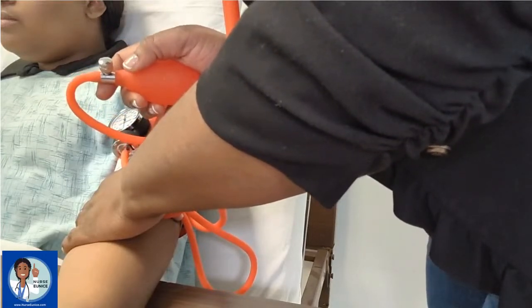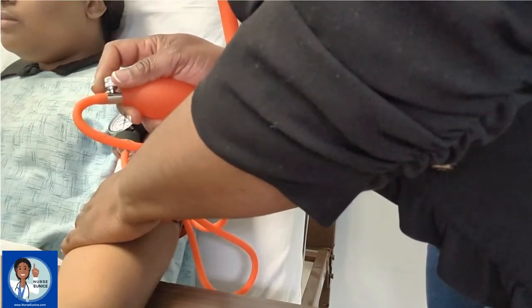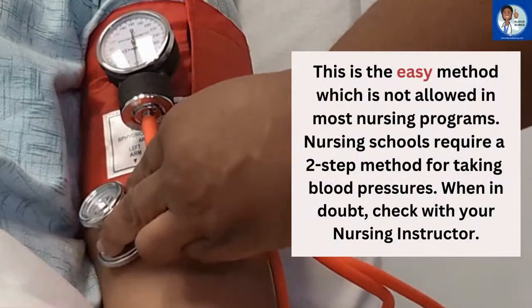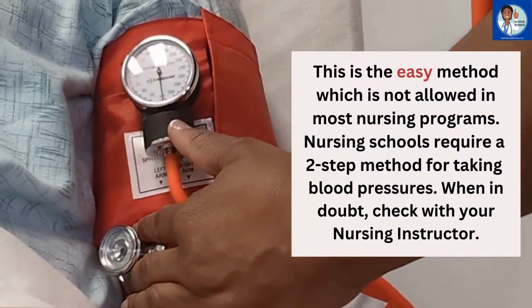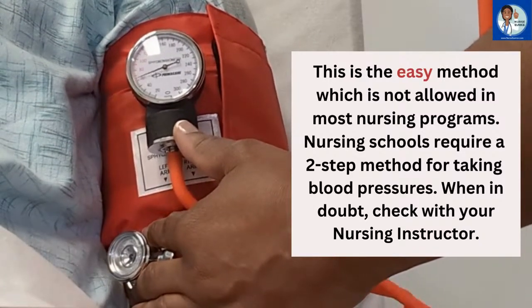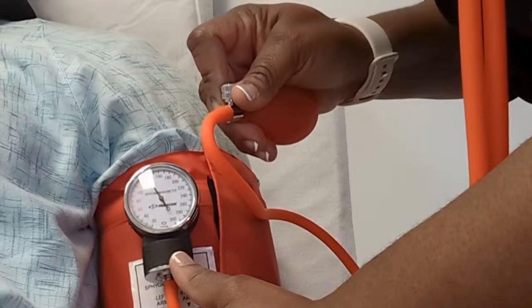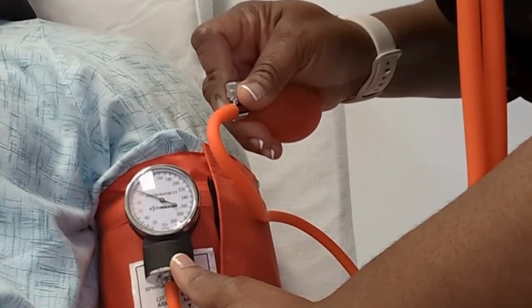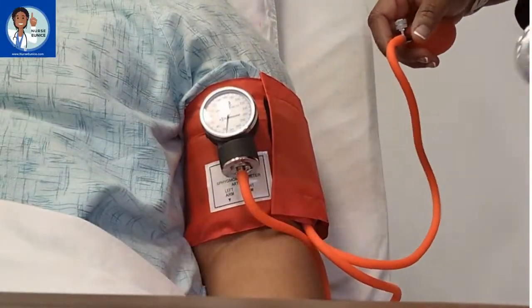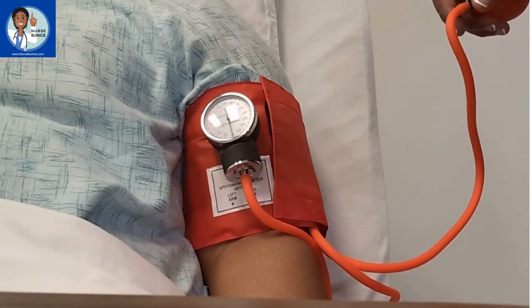When you're going to be inflating the cuff, you have to turn your valve. Remember: righty tighty, lefty loosey. If you want to tighten it up, you turn it towards the patient. If you want to release the air, you turn it away from the patient. We're going to inflate it to about 160 — you'll see the needle moving. We're at 160 and I'm going to turn it slowly towards me. You'll be making note of the first hard tone or Korotkoff sound that you hear and also the last. The first hard tone is the systolic and the last is the diastolic.